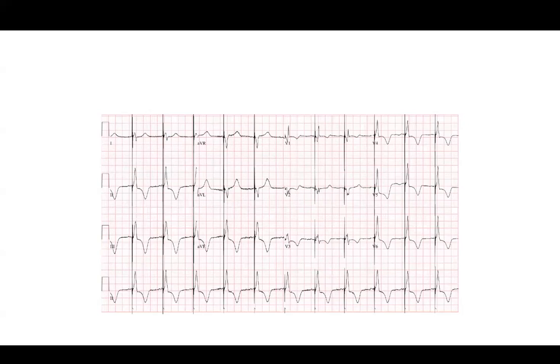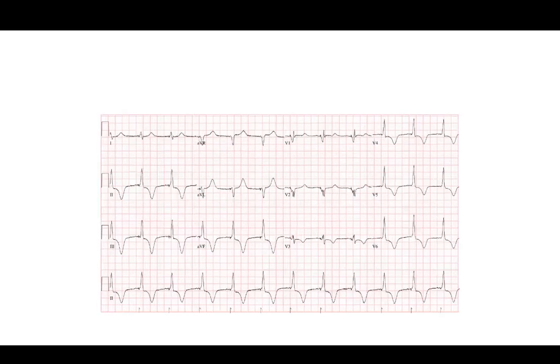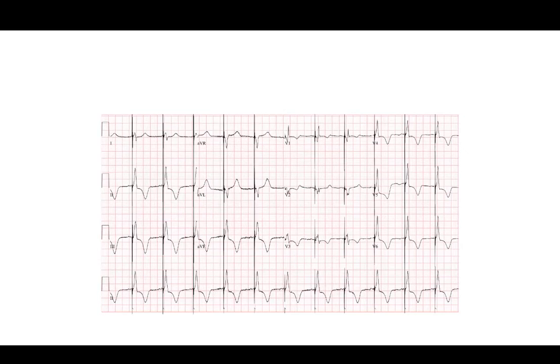That's almost, I mean, sorry? Such a striking change that almost certainly in unipolar, you're now getting the left anterior fascicle there, right? I mean, yeah, I think so. So the other is left septal pacing, and this is through whatever virtual electrode or whatever. Yeah, I think whatever type of it, the LVAT's tighter and everything.